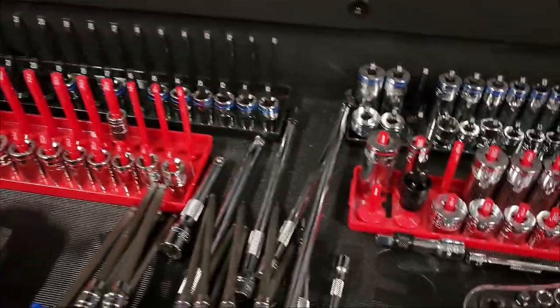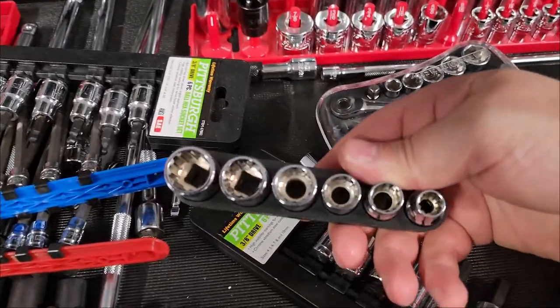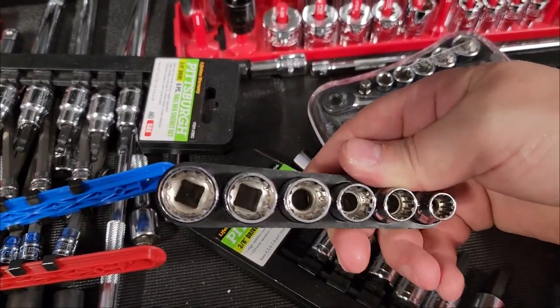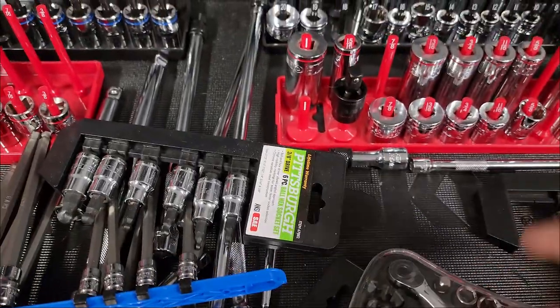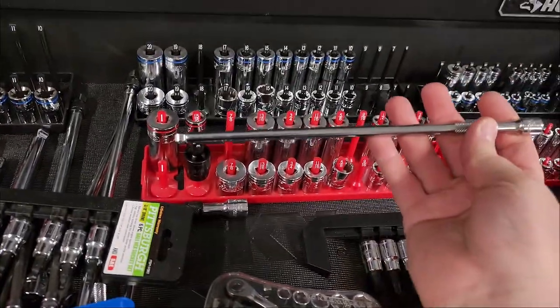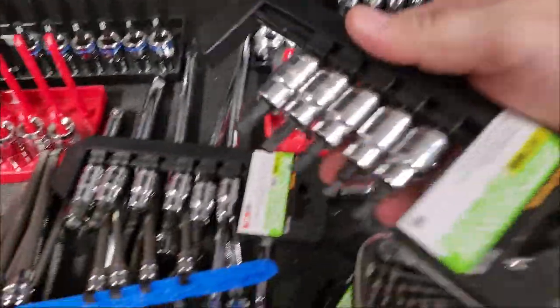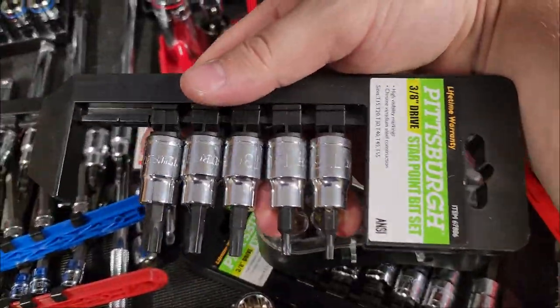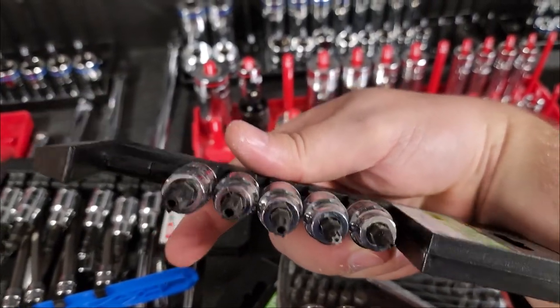There are also star sockets — 12-point or star-pattern sockets — in all different types. Here are some Torx and security Torx sockets; you can see they have holes down the middle for the security pin. These cover a wide variety of fastener head types.